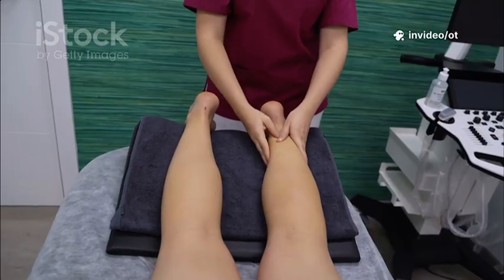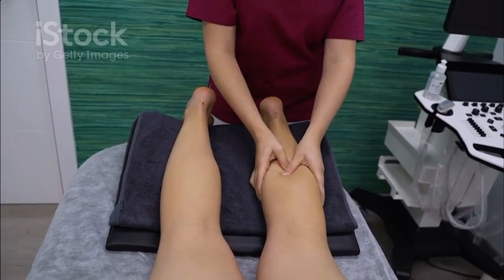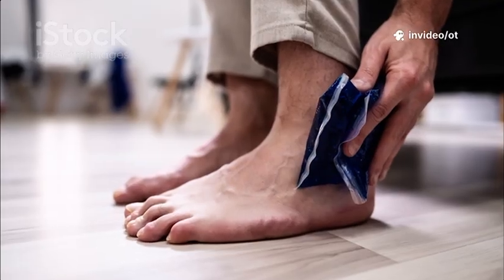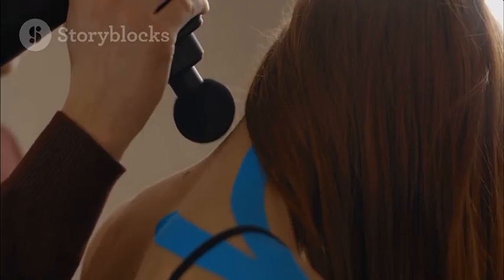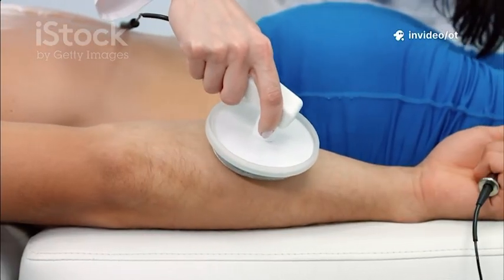The true value of modalities emerges when they're integrated into active rehabilitation, never as the sole treatment. Identify the primary impairment: acute swelling and pain, chronic stiffness and limited mobility, poor activation and weakness. Let that guide selection. Cold on an acutely sprained ankle limits edema and enables early gentle ROM. Ultrasound to a stiff shoulder capsule, then immediate mobilization and stretching. NMES to the quadriceps followed by voluntary sets and sit-to-stands to translate into function.